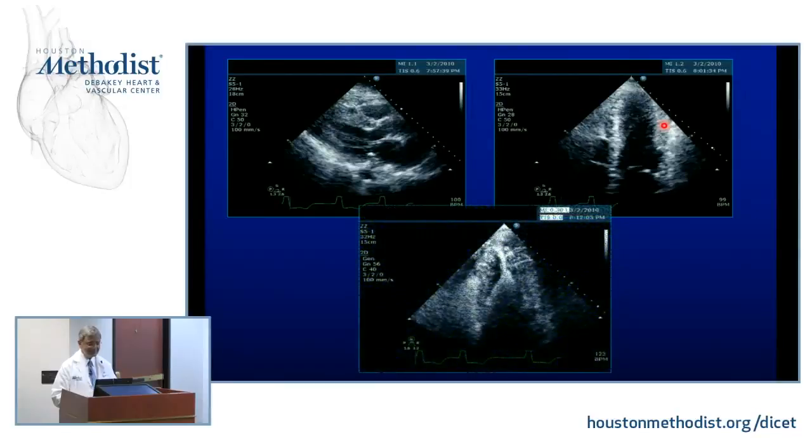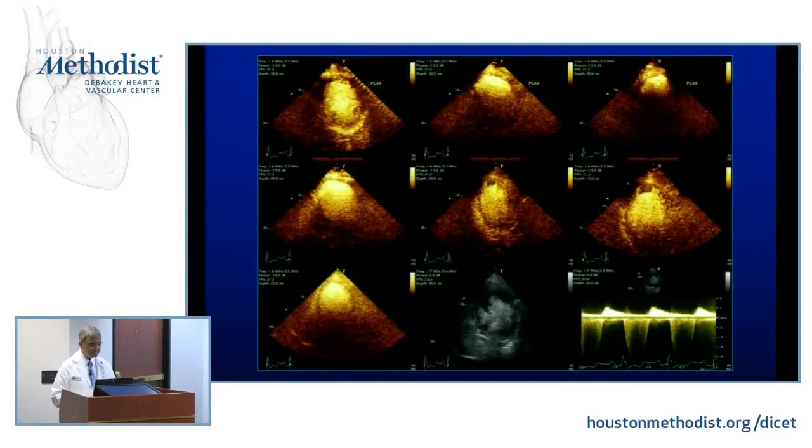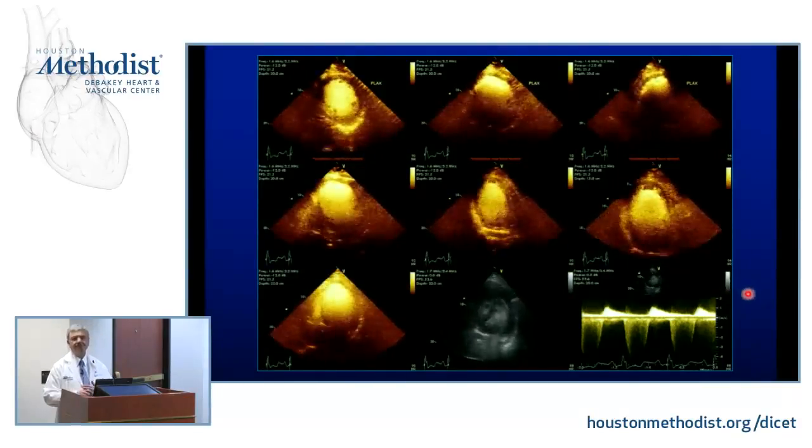Indeed, that's the situation. So just for interest, I'm going to go back through all the slides and point to them so you can see. Look at this. This is an amazing apical hypertrophy, and you could see actually the arterioles that are filled with contrast going forward. Okay. This is a question for you.